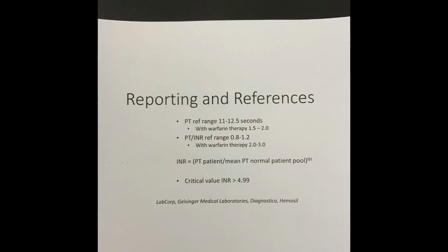There are some unusual reporting requirements for PT assay results. Let's talk reference ranges first. Typically, for a normal patient population, it takes about 11 to 12.5 seconds for their specimen to clot in the PT assay. With warfarin therapy, remember we're trying to prolong that PT because those patients are prone to hypercoagulability, and so we're looking to elongate or prolong that PT by a factor of 1.5 to 2-fold.